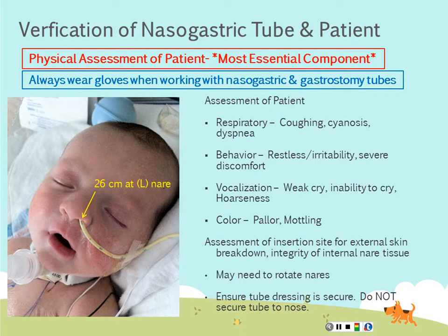One of the things that you can do is take the end of that tube and wrap it around the back of their ear and run it down the side and stick it underneath a onesie or their shirt. But they also may use soft limb splints on their arms to keep them from pulling at that tube. Those are known as soft limb restraints. They're considered a medical intervention, and they are not considered to be a behavioral restraint when working with children.